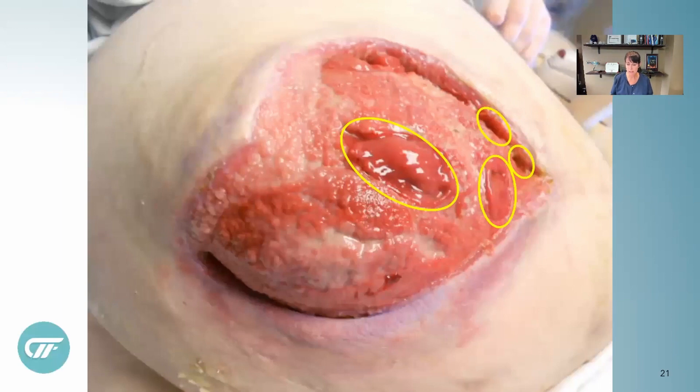If you have a group of fistulas and you have a big wound, like this gentleman had this big wound, he had this group of fistulas. We wanted to isolate the fistulas, but still heal the rest of this big wound.